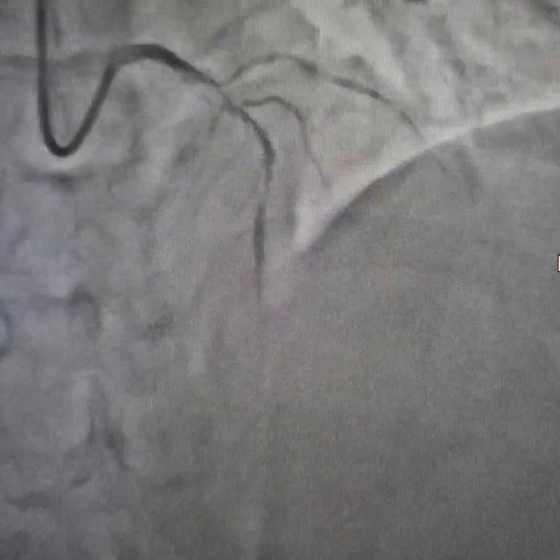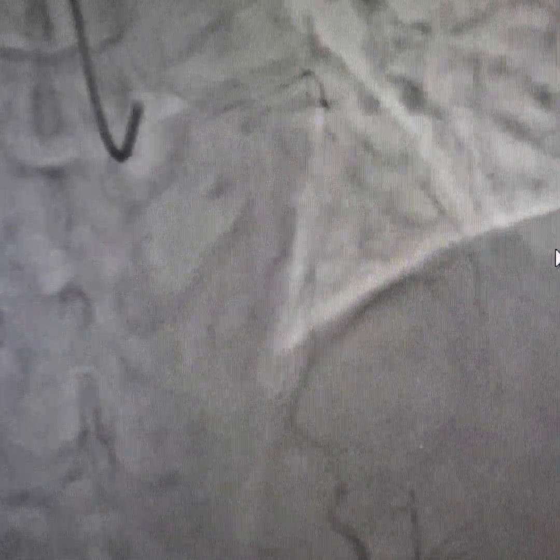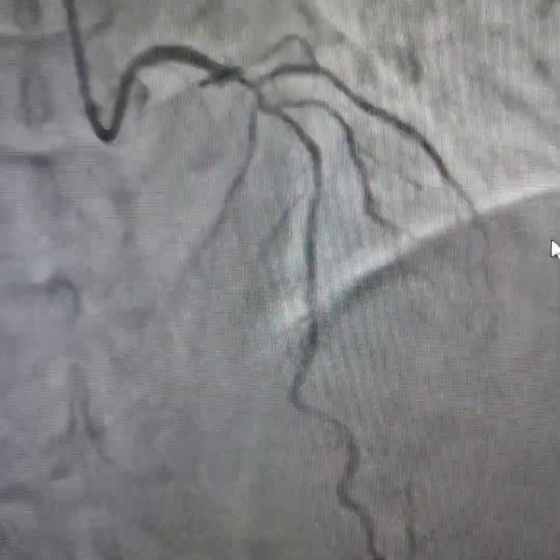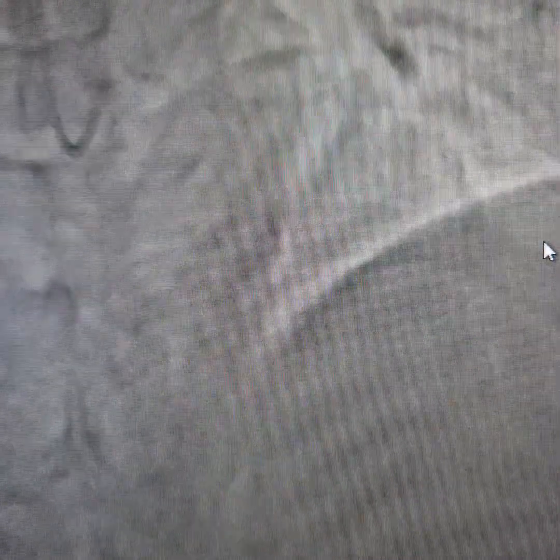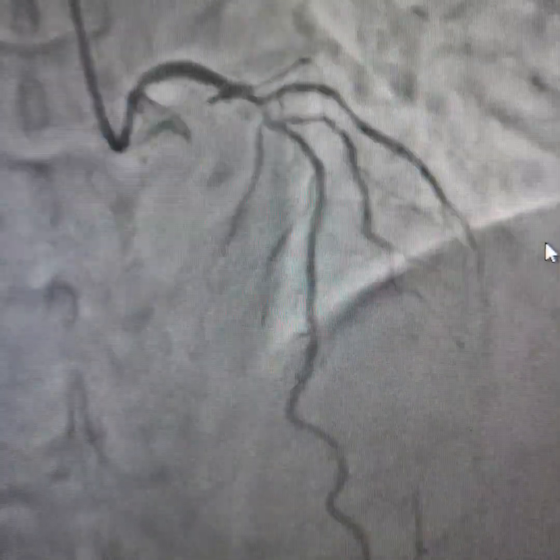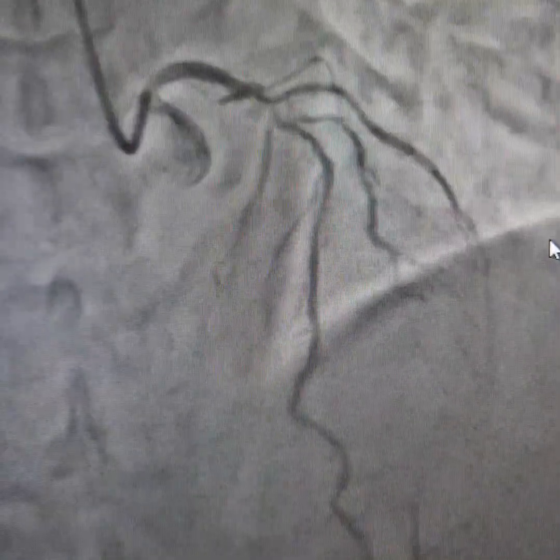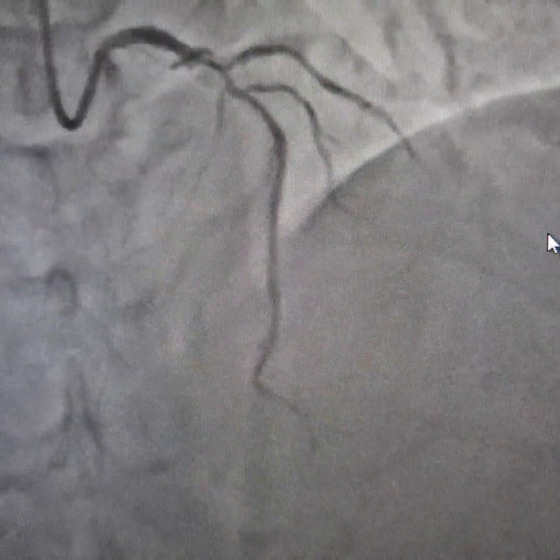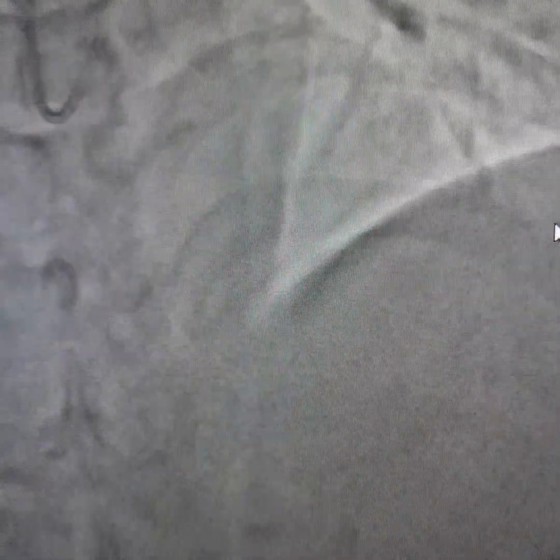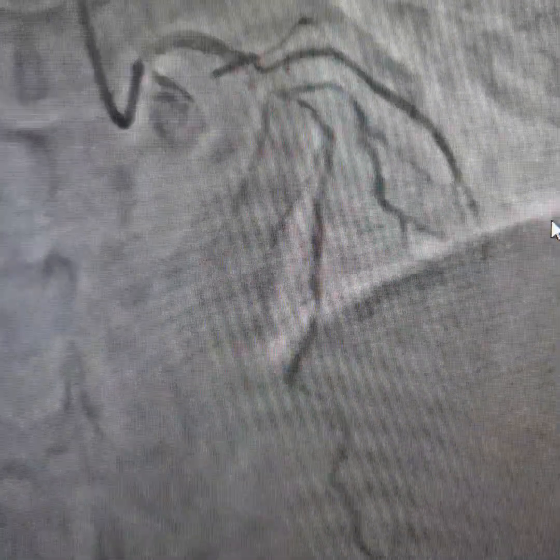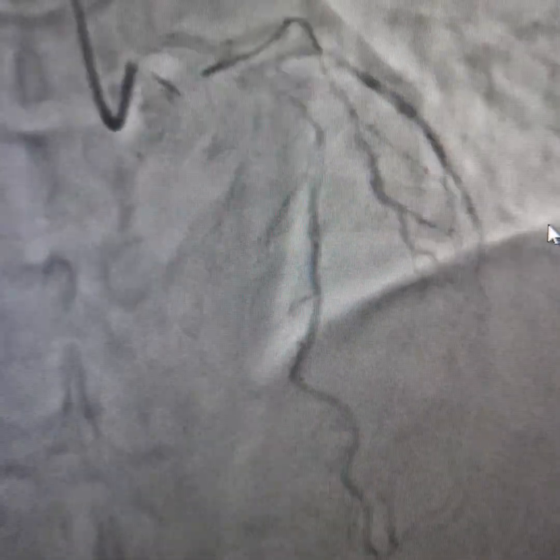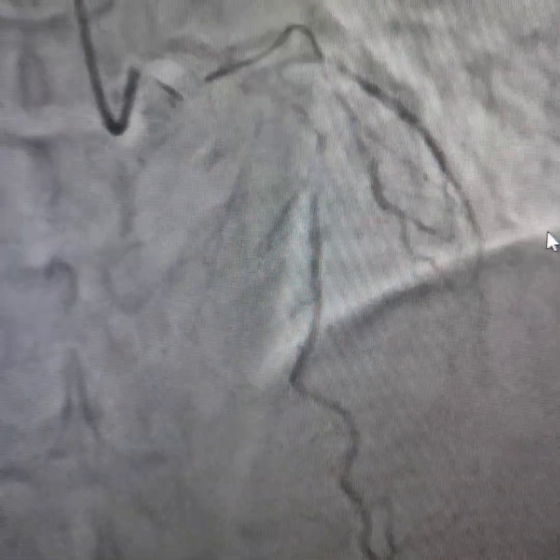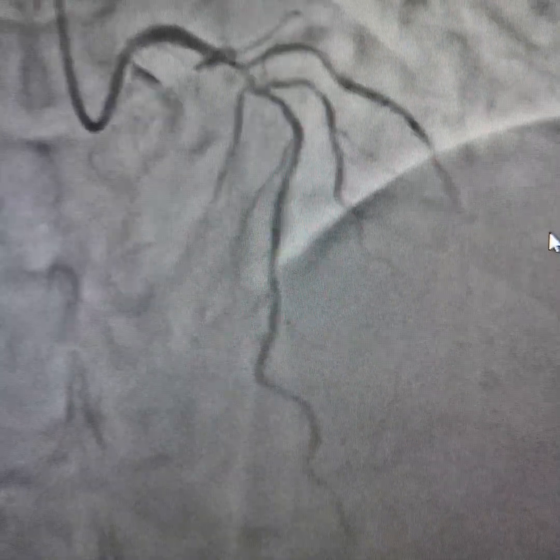This was the cranial view. You can see a diffusely diseased LAD with a lot of calcium. The patient was in the government health package so we had a lot of limitations, and the patient was not willing for bypass surgery and had given that in writing. So we had no other option but to go for stenting from the left main to the LAD.